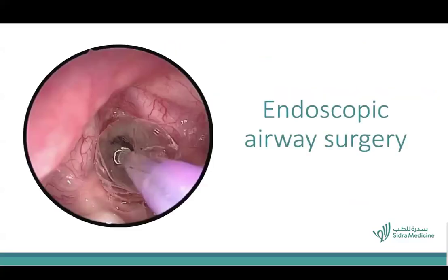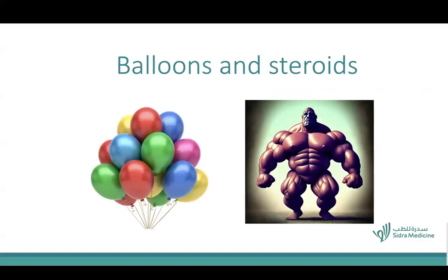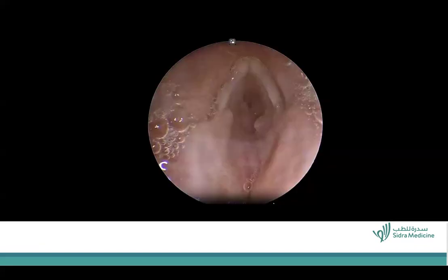Okay. I'll give you an example of what an endoscopic airway surgical procedure looks like, where we routinely dilate the subglottic area. We also inject steroids in those areas to minimize the effect of inflammation or start to reverse the inflammatory process. This case came to us, as I mentioned before, at about 10 p.m. one night. The patient had been intubated at an outside facility for about 3 months, was discharged home a month after leaving the ICU, and presented to our facility with inspiratory stridor. So that patient we took in.